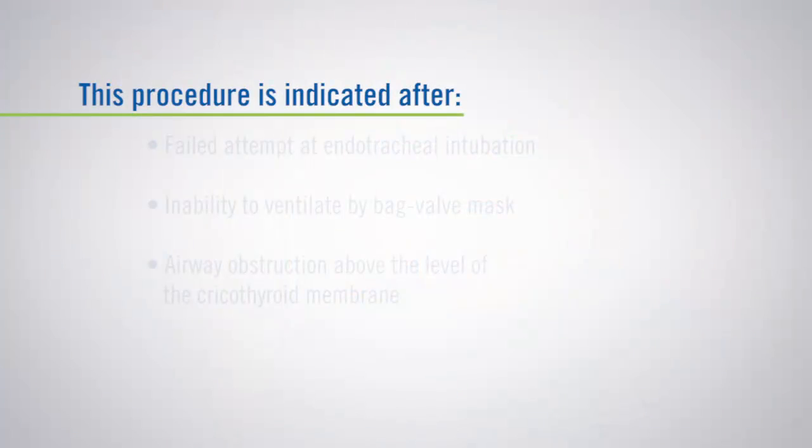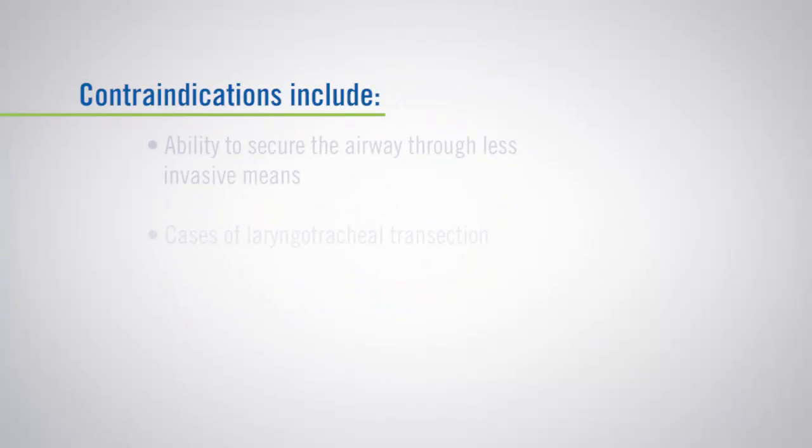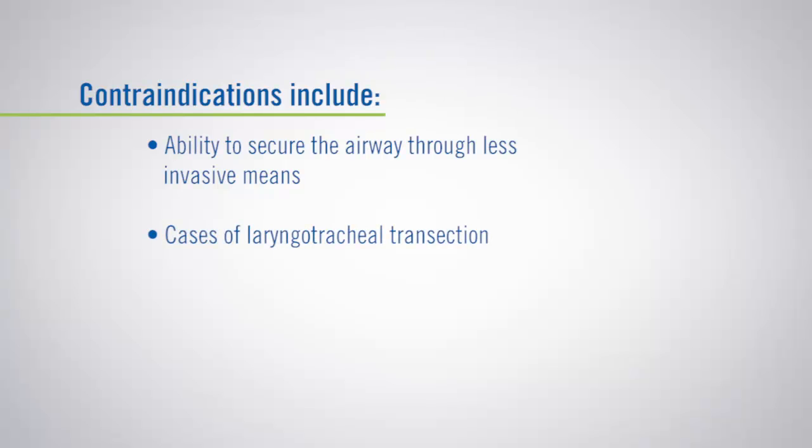More specifically, this procedure is indicated after failed attempts at endotracheal intubation, the inability to ventilate by bag valve mask, or airway obstruction above the level of the cricothyroid membrane. Contraindications include the ability to secure the airway through less invasive means, or cases of laryngotracheal transection.